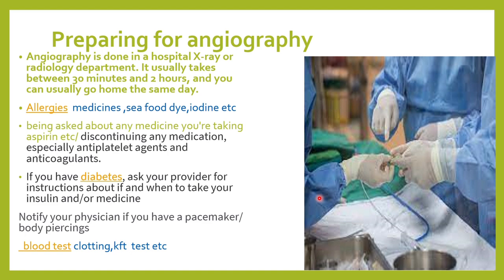So, how do we prepare a patient for angiography? Before this, I have made a video on what an angiogram is, what the indications of an angiogram are, what the different types of angiograms are, and what the different methods are to find out heart blockages, etc. You can also go through that video. So, how do we prepare a patient for angiogram?